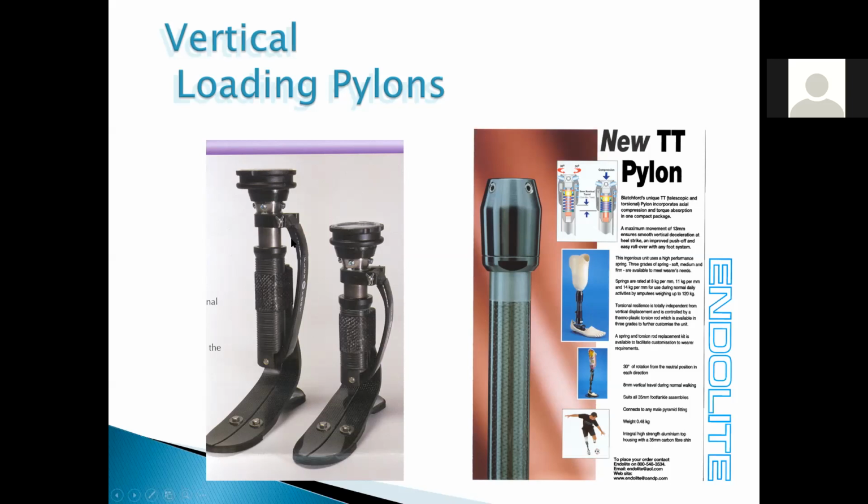This actually looks like a part of a car. What does this look like to you? Shock. Well, the shock, actually, we haven't had exactly shocks since the 80s, whoops, somebody has an idea. Let me look. Leaf spring? Okay, well, I suppose that's true. But let me describe this a little bit. So what we have had in cars since the 80s are struts, right?